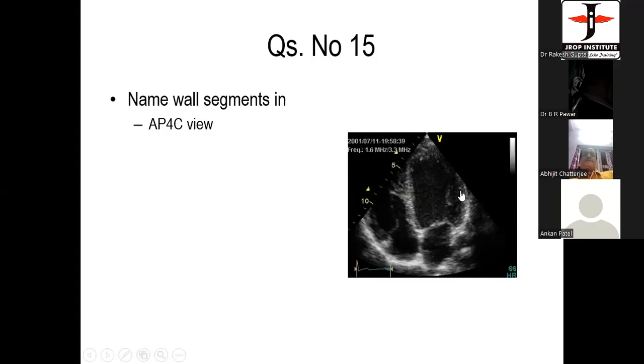In the apex, is there inferoseptal? In the apex, there are 4 segments: anterior, lateral, inferior, and septal. So that is septal. Dr. Gupta, sir, can you show another segment, please? What segment is that? Sir, that is the anterior segment, sir. Anterior? Sir, mid-anterior, sir.